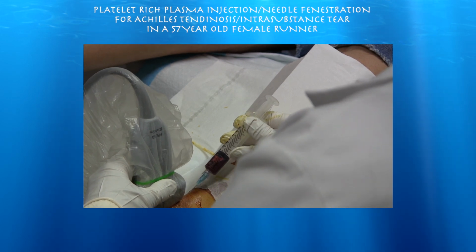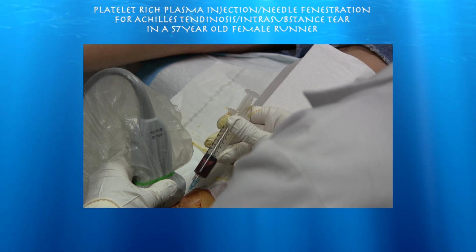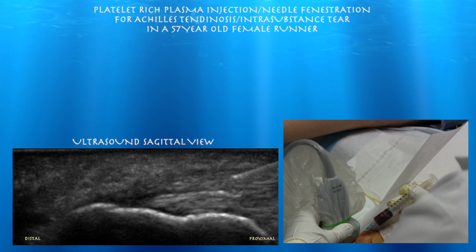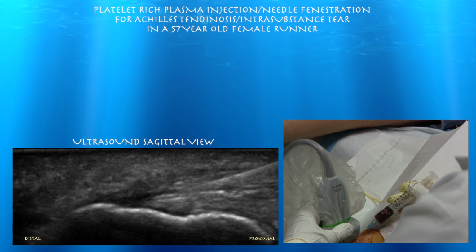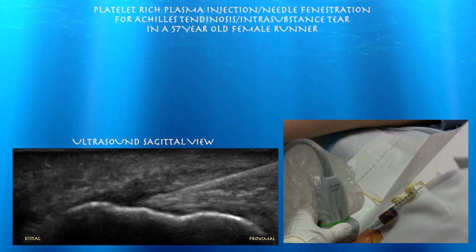Here's our first clip. We're just going to try to go and kind of break up the calcium a little bit. And here you can see the thickened Achilles tendon as it approaches the calcaneus that's highlighted in yellow. And also there is a small little intrasubstance tear and a little calcification distally as well. I'm going to go a little bit medially on our second clip.